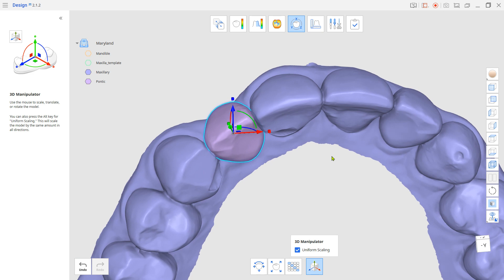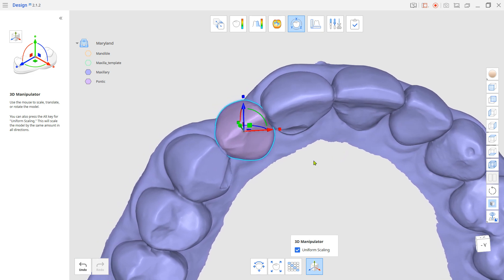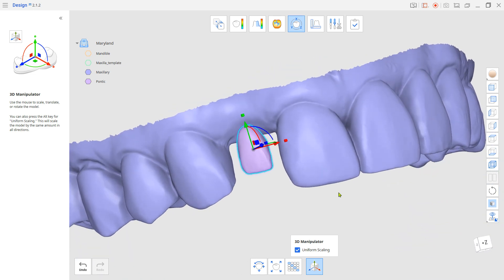If you want to design the Maryland Bridge Framework for a porcelain job, try to make the Pontic Teeth about one-third their size at this step.